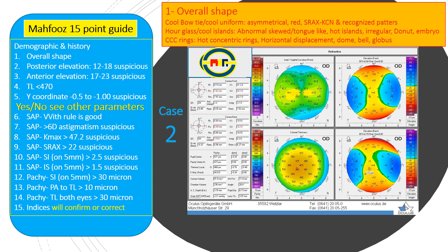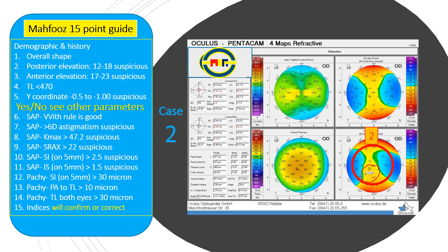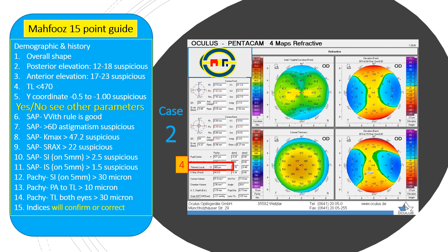Number two: posterior elevation in the center is 12 microns, which is right at the start of the suspicious range. Number three: anterior elevation is all less than 17 microns, so that is in the normal range. Number four: thinnest location is 468, just less than 470, so that is in a suspicious range. Number five: the y-coordinate is minus 0.48, very close to minus 0.5. Out of the first five, the overall shape, posterior elevation, thinnest location, and y-coordinate are suspicious — so perhaps it's not a normal cornea.